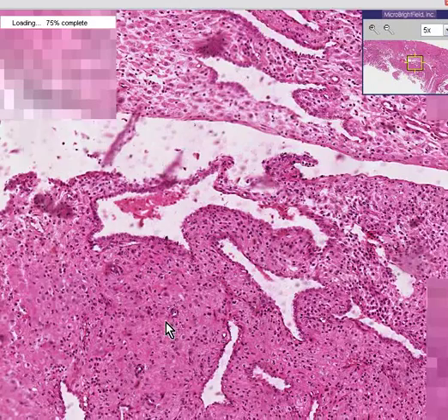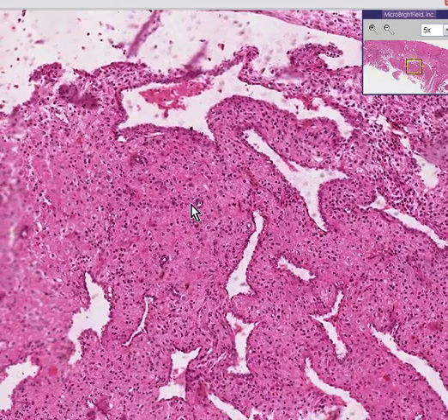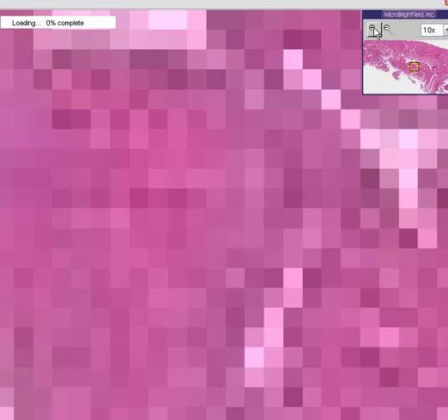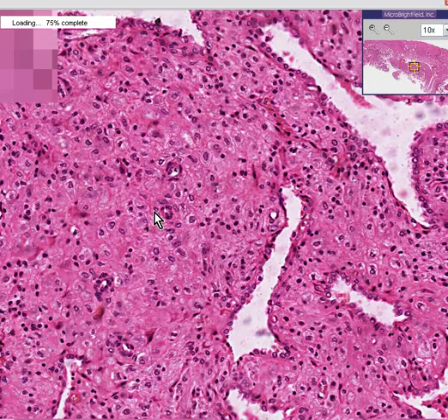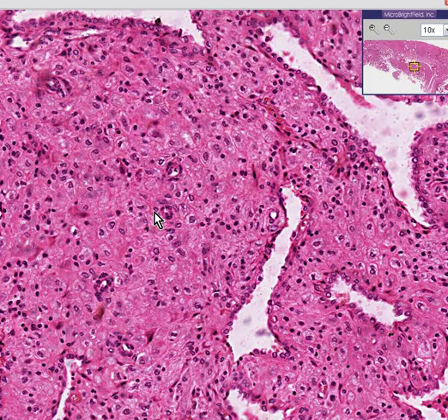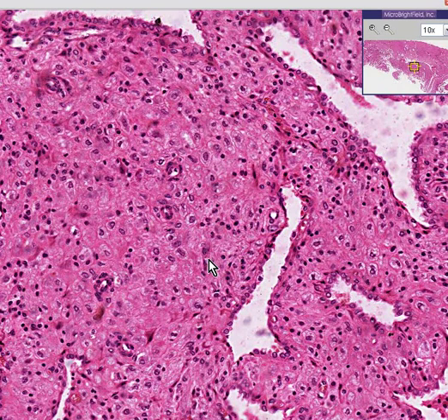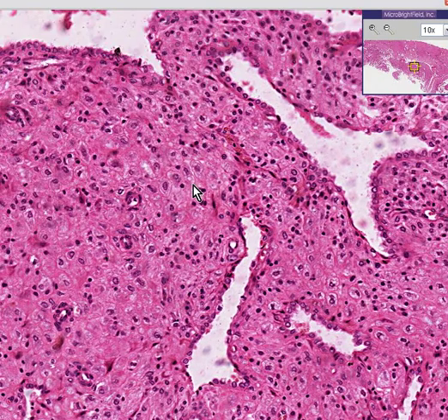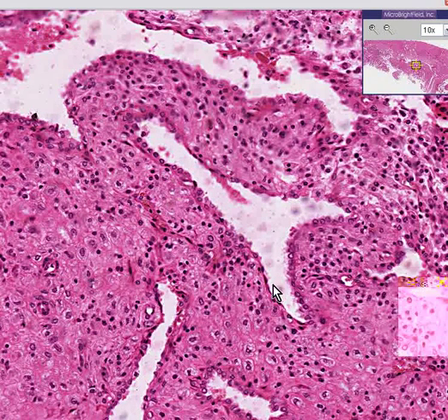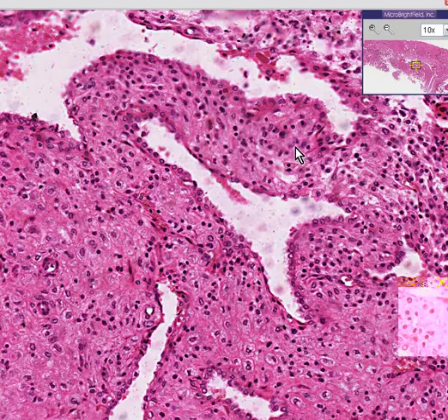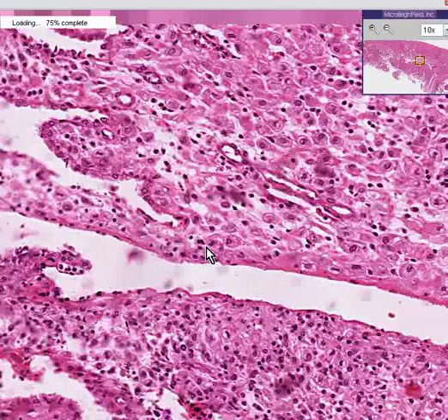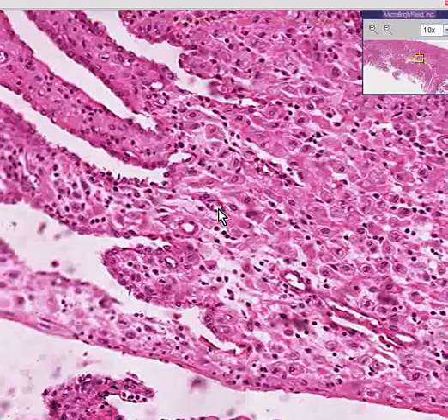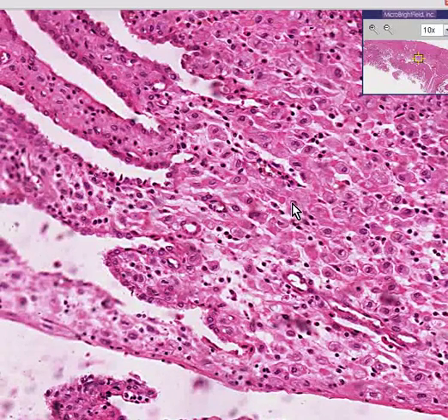The reason why the stroma is so abundant is because the stromal cells are under the influence of progesterone, which makes them plump and big and numerous, and basically crowds out the smaller glandular spaces like you see here. This is an endometrium that has been under the influence of progesterone, causing a growth of these decidual cells.